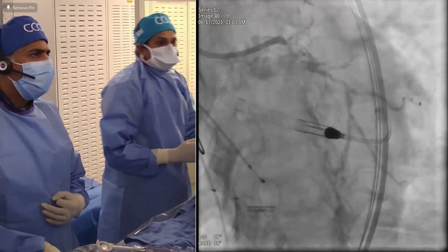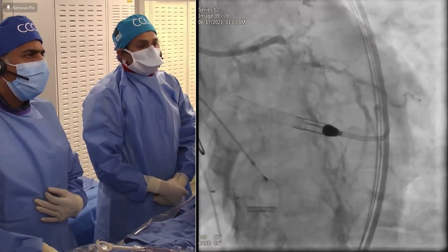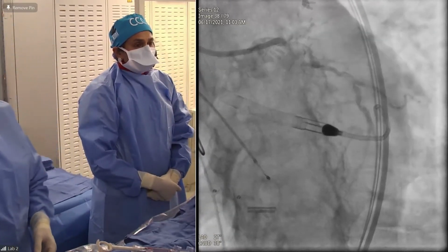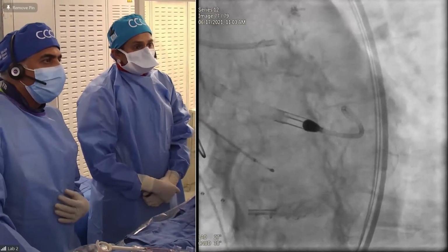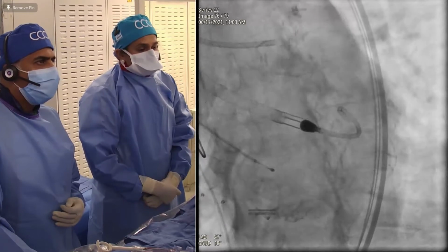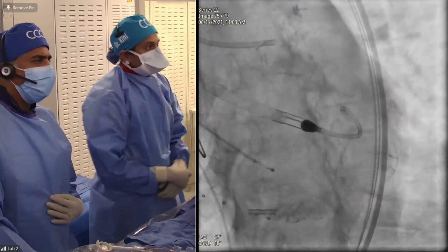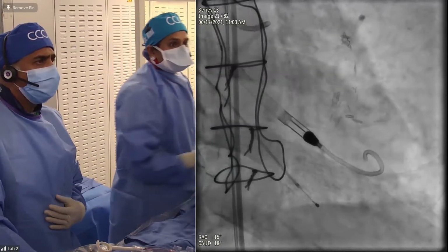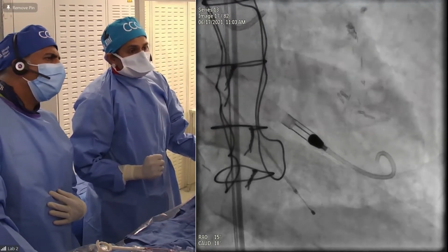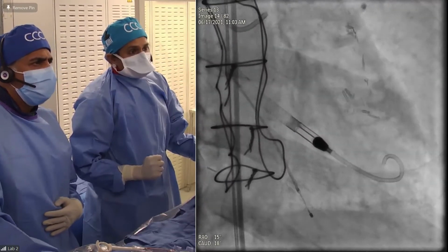So this is the left main to circumflex, dominant circumflex, calcified, angulated. Diffuse, yes. Does it almost look like disease? It's totally occluded, or with a very, very small antegrade flow, and almost like a bridge collateral, no? What does everyone else think here on the anatomy? Some of the haze from that calcium. Let me give you another view. I think the CTO will have a lot of bridging collateral. Okay, that's a better view. It shows the calcium, too, 99% right? Antegrade flow there. Yeah, heavy calcium.